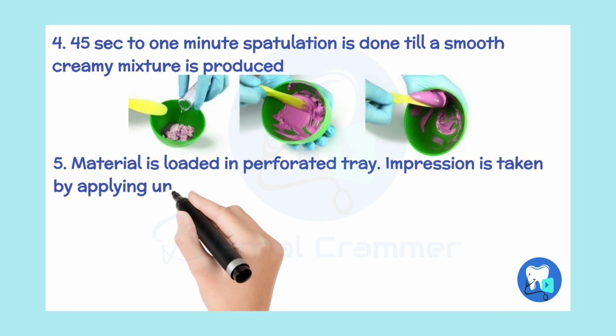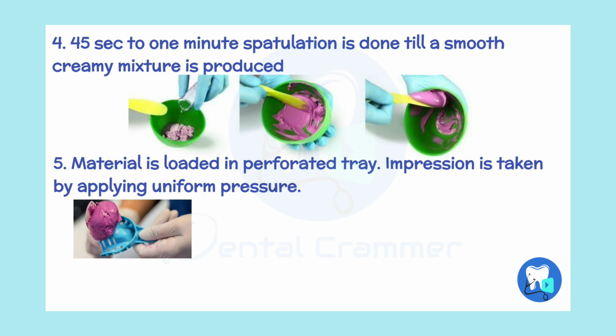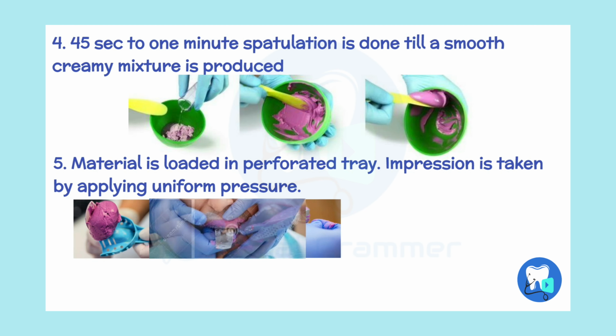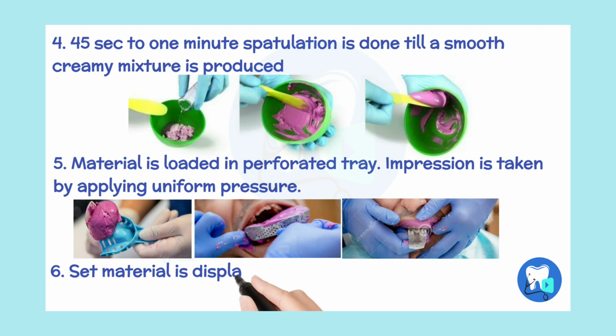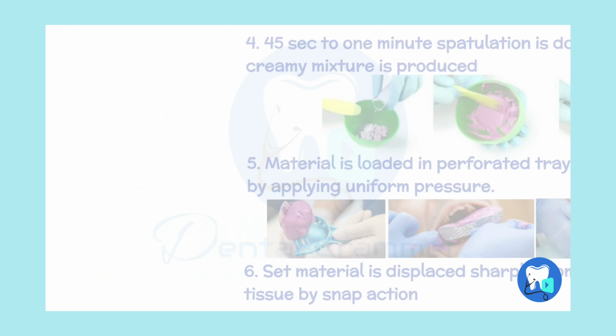Material is loaded in a perforated tray and the impression is taken by applying a uniform pressure. The tray is held in position until the final set. The set material is displaced sharply from the tissue by snap action.